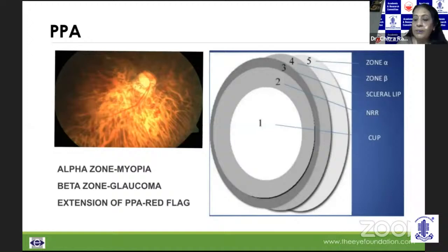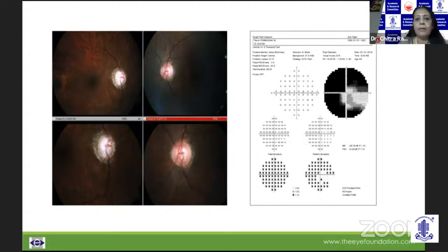If you look at this disc, it is obviously vertically oval and has PPA with the field effect — all of it together lets you know that we're looking at advanced glaucoma here.